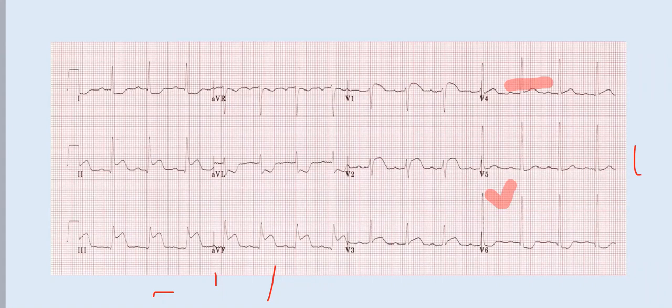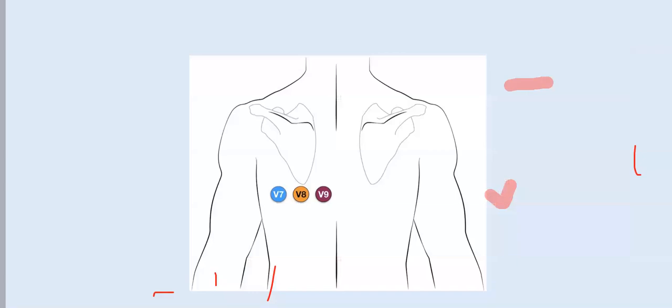طيب. Now back to the posterior. The posterior aspect of the heart is not seen by the ECG camera on the 12-lead ECG, which are all positioned anteriorly. So if you want to pick up the electricity from the posterior part of the heart, go posteriorly. So you have to have V7, 8, and 9 below the scapula, okay? You have to do that. And now it's recommended as routine for all inferior wall MI to extend the leads posteriorly, okay? To make sure whether you have it or not.